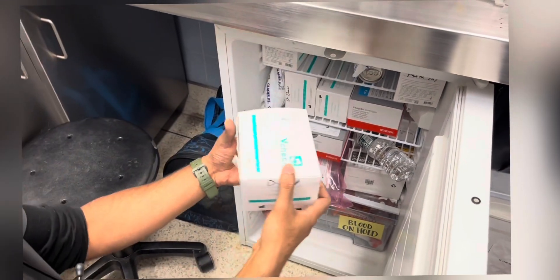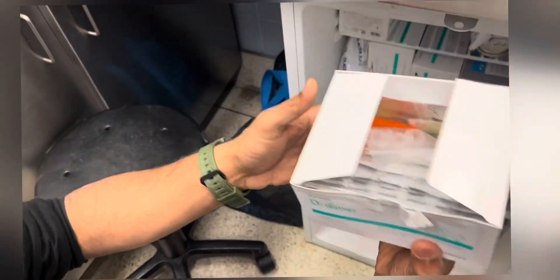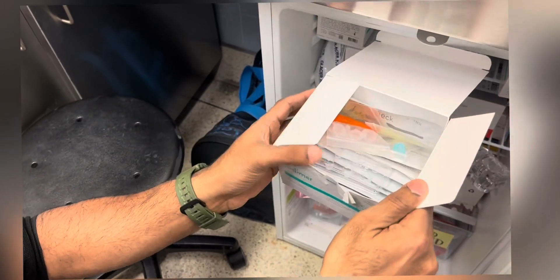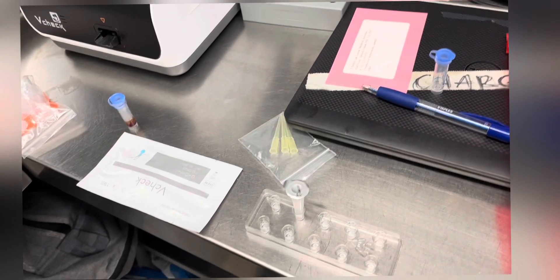Normally all the test cartridges and reagents will be stored in the refrigerator. So before beginning the test, all the refrigerated test cartridges and reagents should be brought to room temperature.